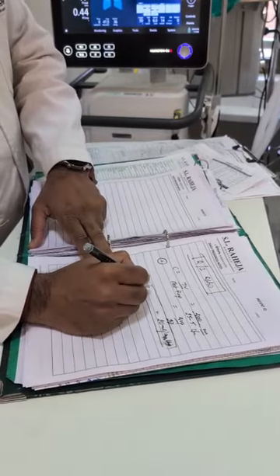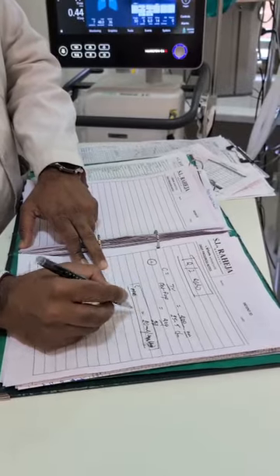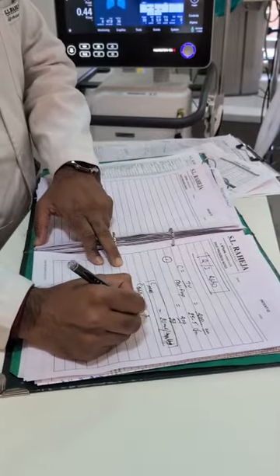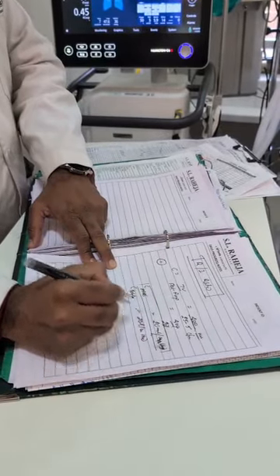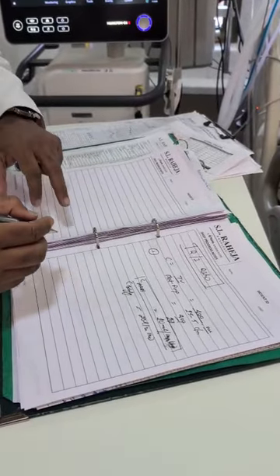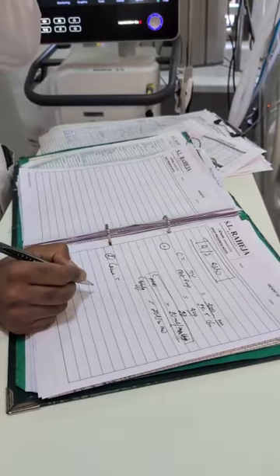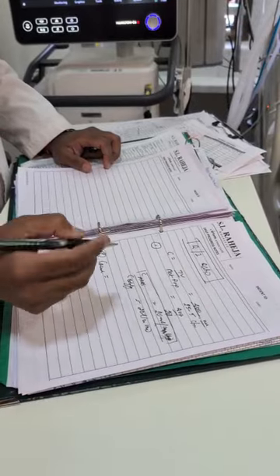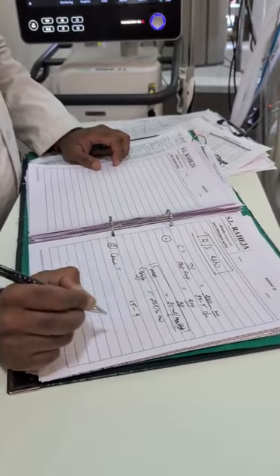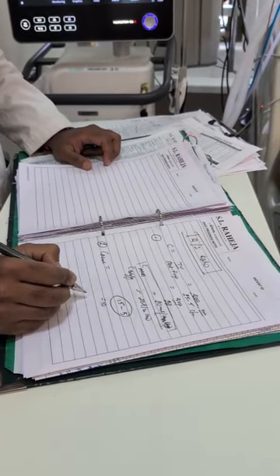Now, this means the compliance of this ARDS lung is 20 ml. That means compliance of the baby lung is 20 ml per centimeter of water. Now, I need to figure out the compliance of the recruitable lung. So what do I do here? Now I am going to find C recruit. First of all, I am going to take my PEEP up to 15 and then drop it to 5. So 15 minus 5 is equal to 10.